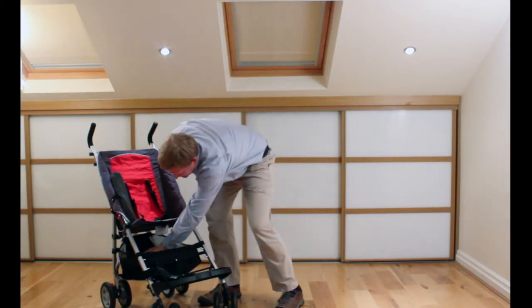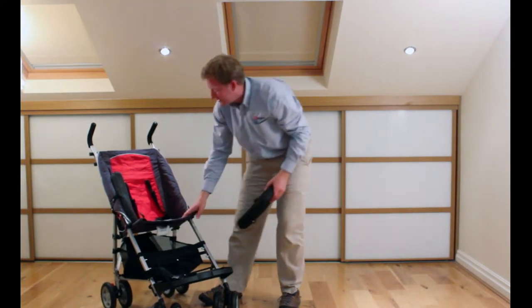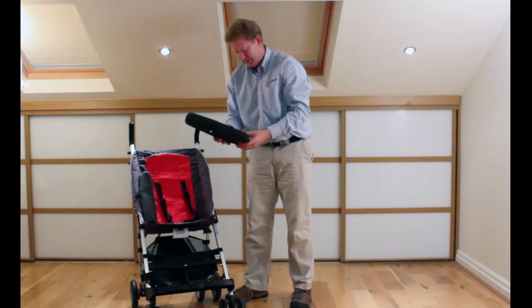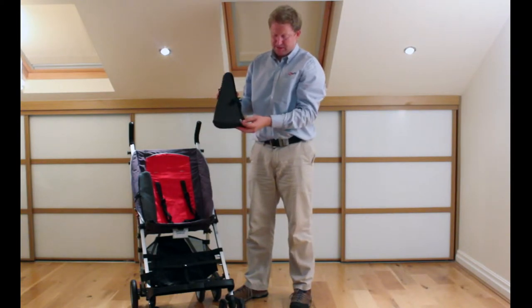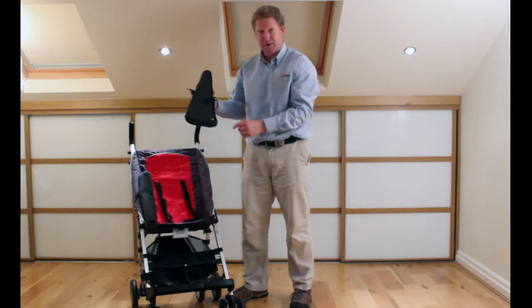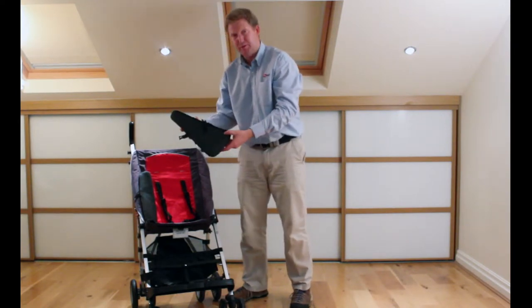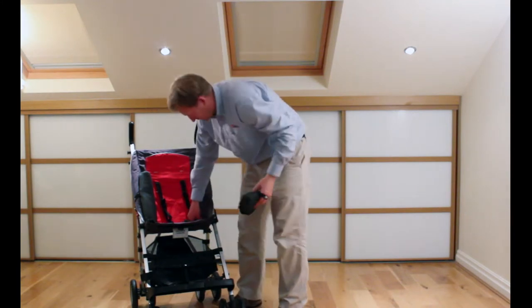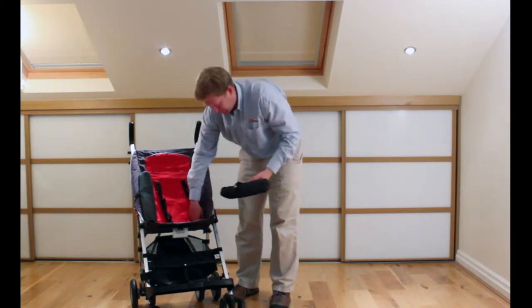So I'll start with the lateral supports. We've got one lateral support already in. There are a couple of eyelets — one at the bottom, one halfway up, and another at the top. You start with the one at the bottom, putting that one in first — there's a little eyelet on the strap at the bottom.